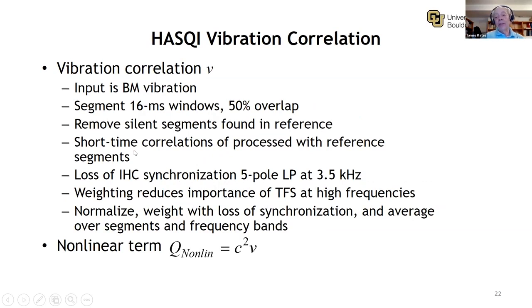We then also look at some changes in vibration, look at changes in the temporal fine structure. And we put this in because for speech quality, we know that if I build something like a noise vocoder, I can get nearly perfect intelligibility, but the quality is still going to be very low because the temporal fine structure, the pitch periodicity effects, for example, have been thoroughly corrupted by the noise vocoder.